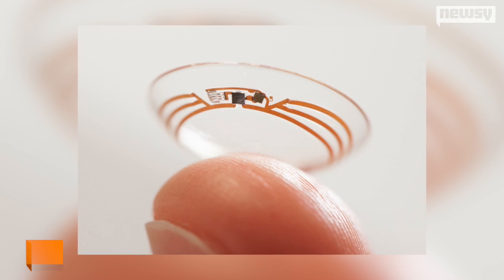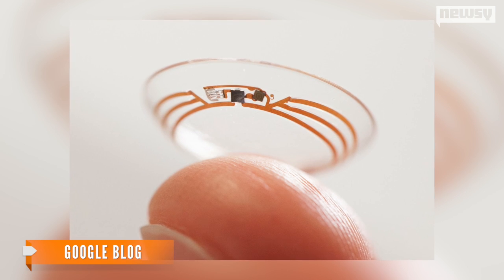Google hopes to help those with diabetes by making it easier to regularly measure glucose levels in the body. The prototype uses tears to measure glucose levels once per second.